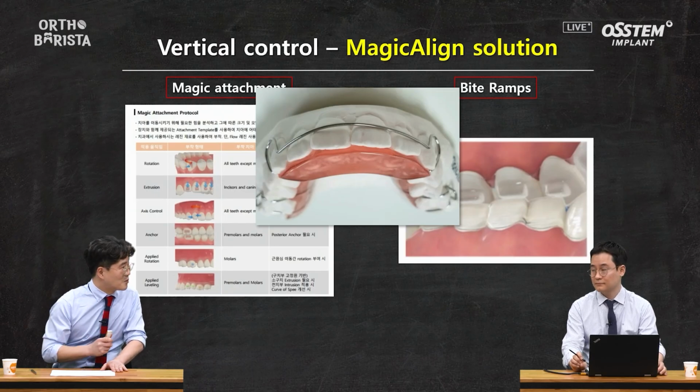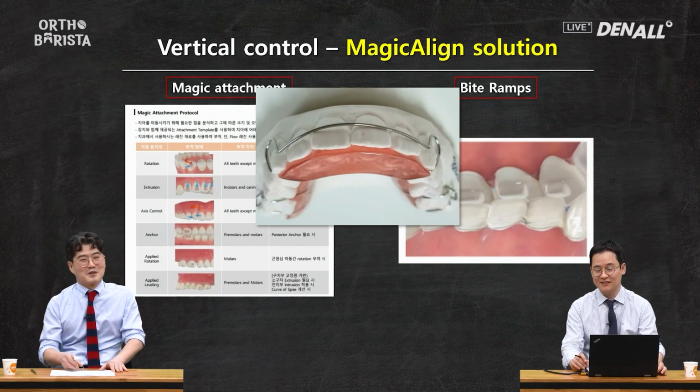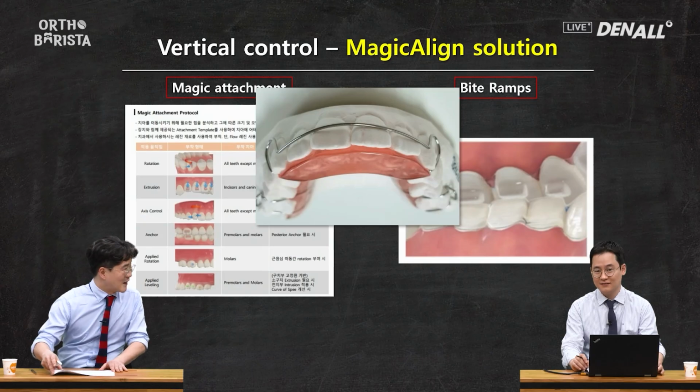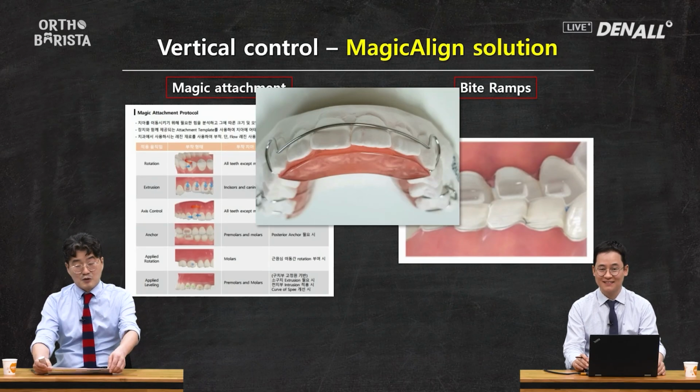This ABP was sent to the lab for fabrication. I recall that last time, you made it yourself. But nowadays, we outsource it like this. These structures can be utilized effectively.